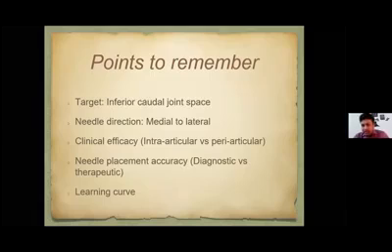The clinical efficacy is controversial, whether to give intra-articular or peri-articular. With ultrasound, probably you might give peri-articular. You might not be able to go intra-articular, but the clinical efficacy has been shown to be the same with peri-articular or intra-articular. So don't worry if you have given peri-articular, as it might give good results also. Needle placement accuracy is better with fluoroscope than ultrasound. So for diagnostic injections, it is better to verify with fluoroscope rather than solely going with ultrasound.